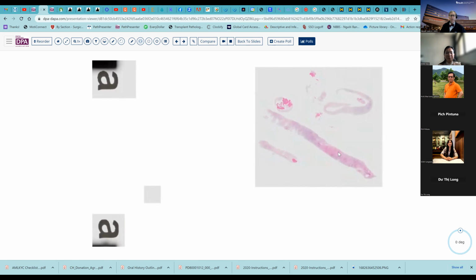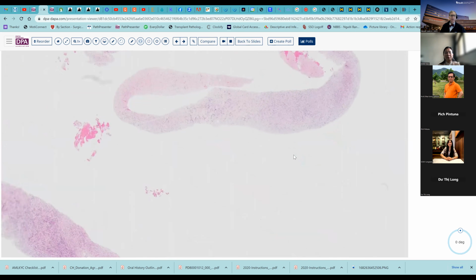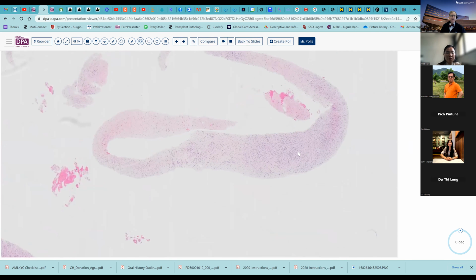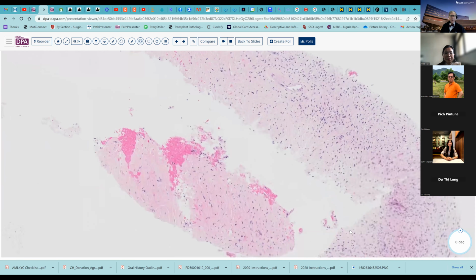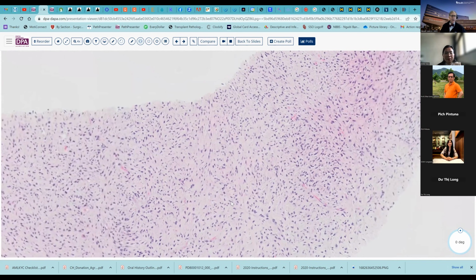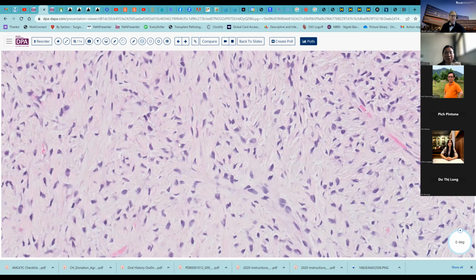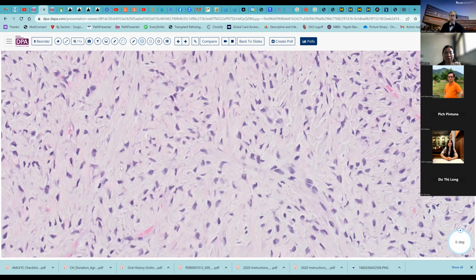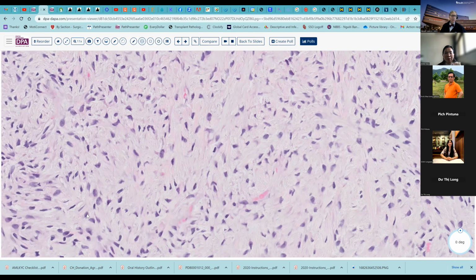So here's a needle biopsy example. And as you can see, it's like our other needle biopsies. It's kind of low to intermediate cellularity. Not very cellular here, a little bit more cellular here, very low grade appearing spindle shaped cells, somewhat stellate. So, you know, this could be a fibromatosis, it could be any of a number of other things that we've just looked at if you're not aware of the clinical situation and so forth.